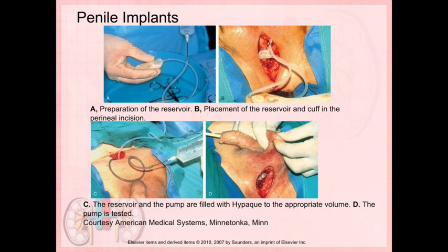Penile implants are placed to treat impotence usually caused by a neurological disease, diabetes, vascular disease, or psychological issues. Many medications can also cause impotence, and men will refuse to take their medication for this reason. There are many types of penile implants available through various manufacturers.